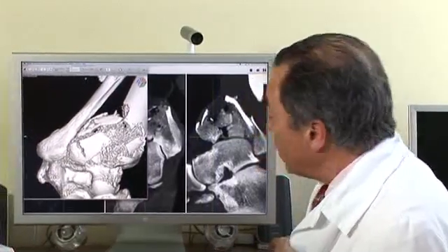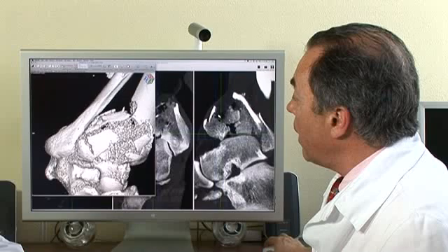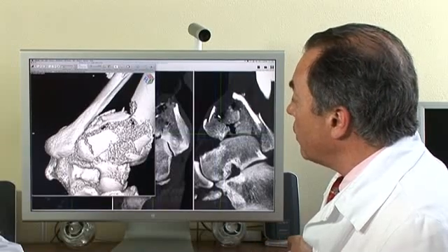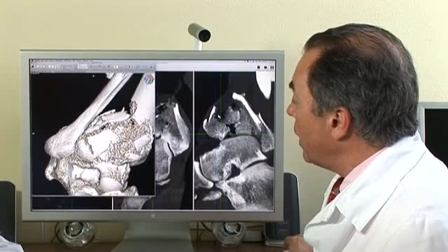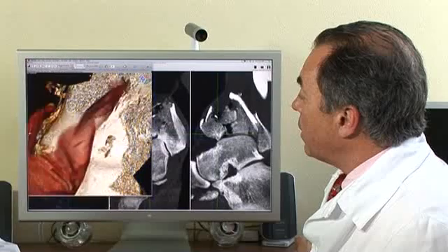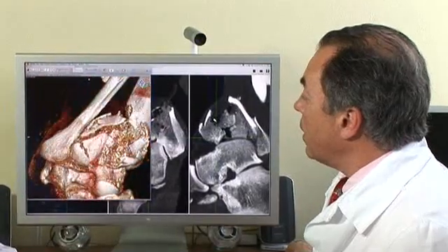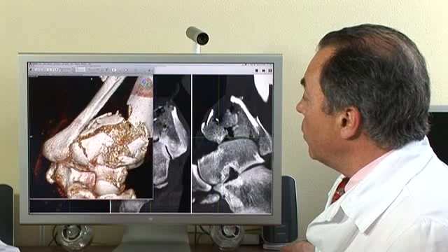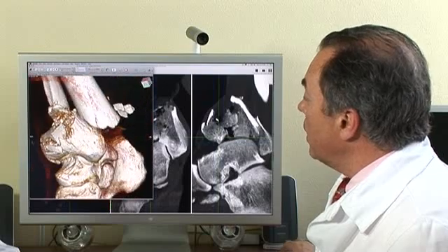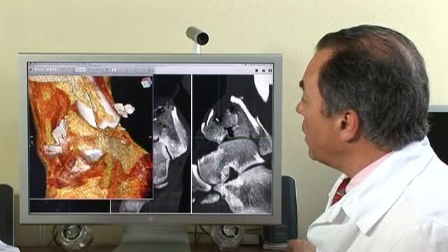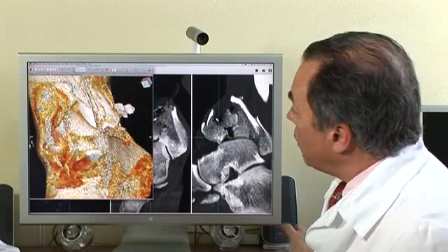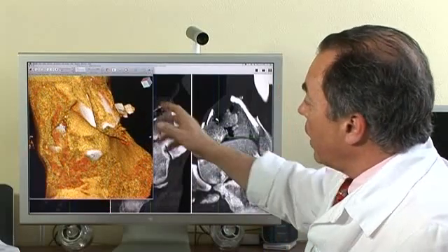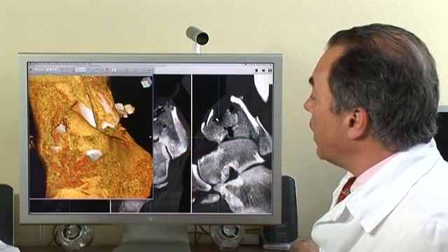You can also change the contrast of the soft tissue. You can bring back soft tissues or change the contrast of those images by adjusting what skin could look like. You can change from muscle to skin views, move this around, and see that it is really an open fracture — with skin and fragments visible — and view it in any orientation.